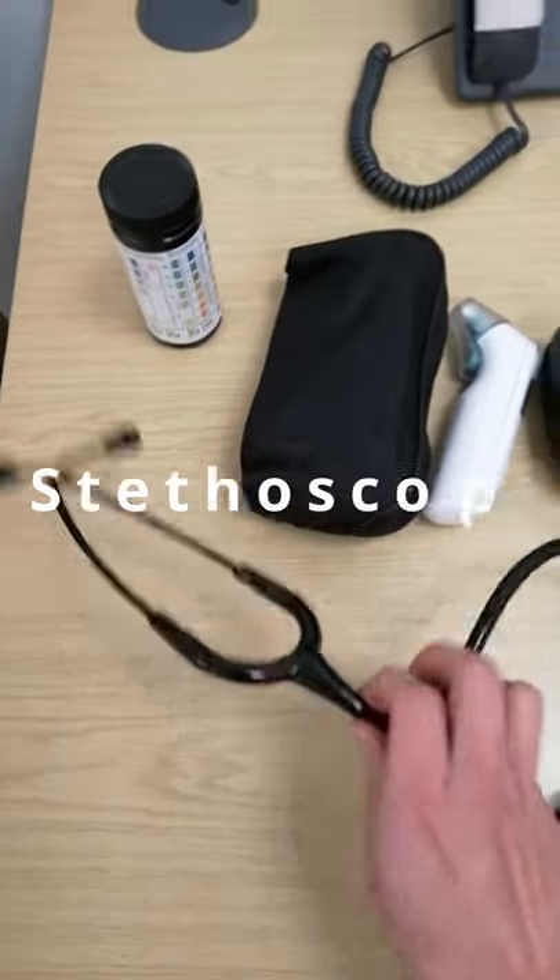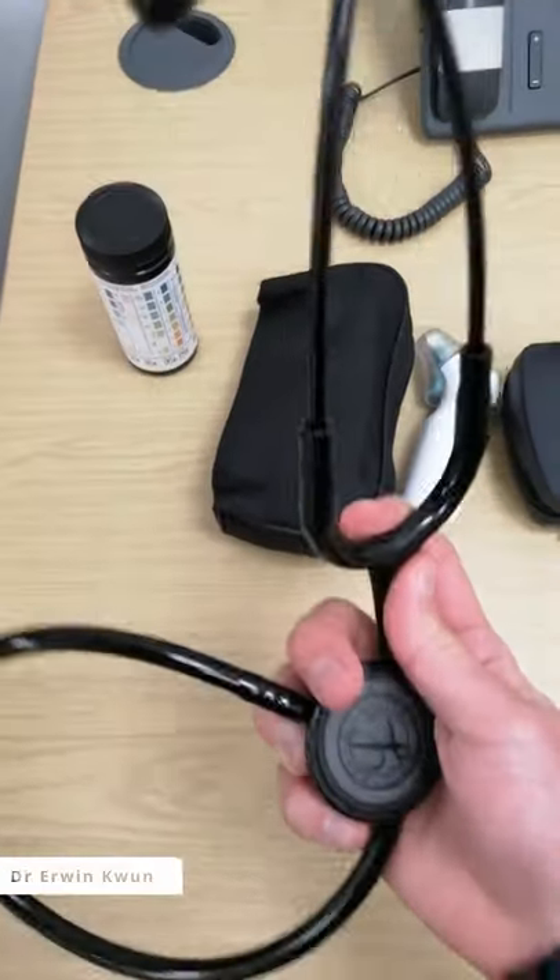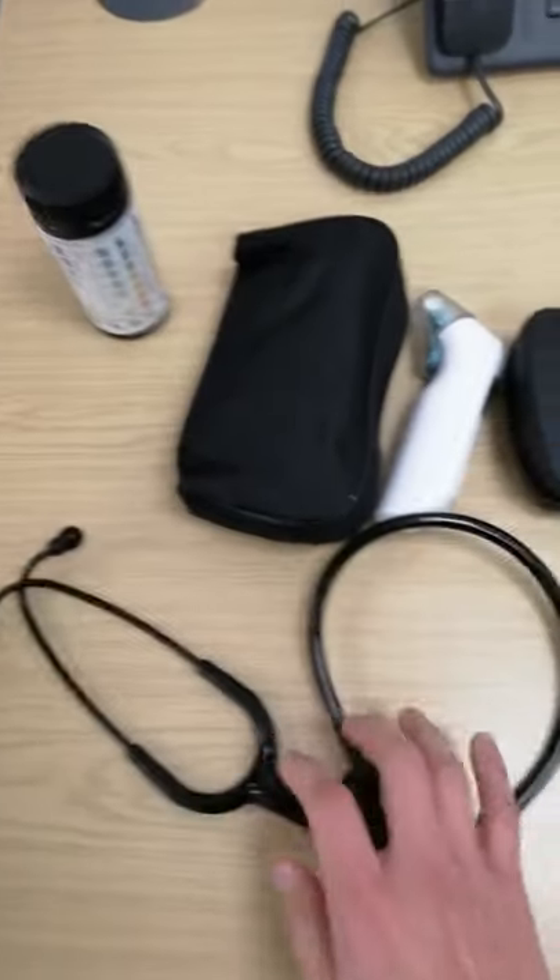Today I'm going to show you the equipment I use as a GP. This is my Littmann stethoscope. I've had this Littmann stethoscope since I was a medical student, and it is still in good condition.